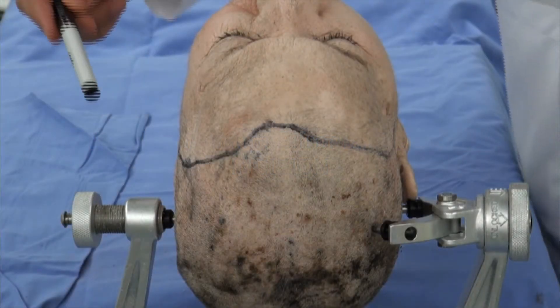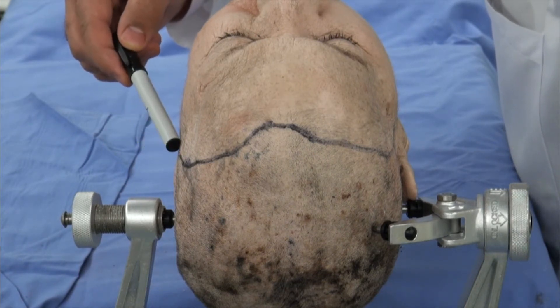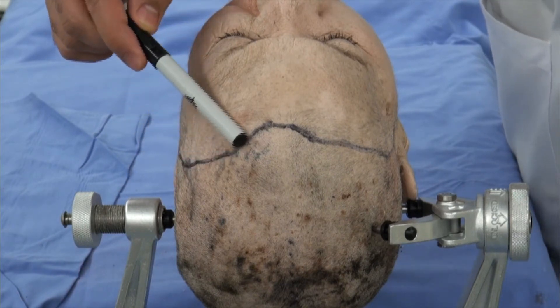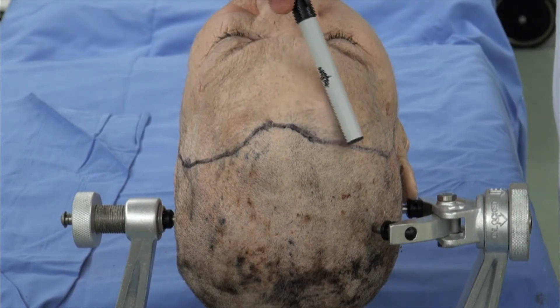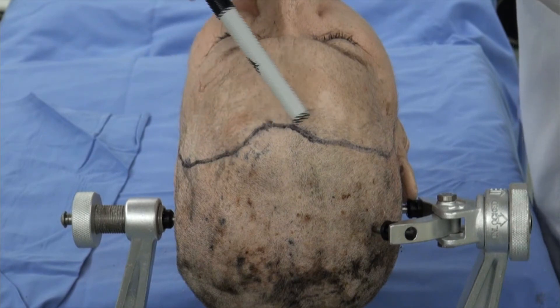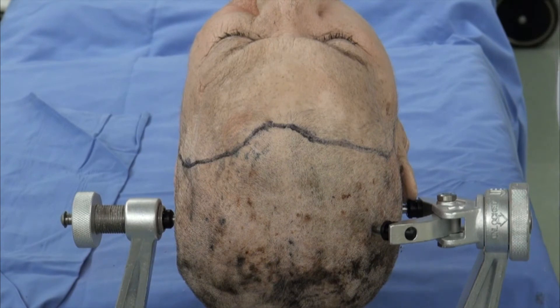For the bifrontal craniotomy, the incision starts from anterior to the ear, about a centimeter anteriorly, just at the level of the top of the pinna, staying behind the hair line, maybe curving slightly anteriorly along the midline, and then staying behind the hair line posteriorly up to the level of the ear contralaterally. Staying just behind the hair line provides an easier way to reflect your scalp flap anteriorly, and this incision often provides ample exposure of the bilateral frontal bone.